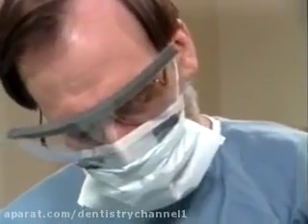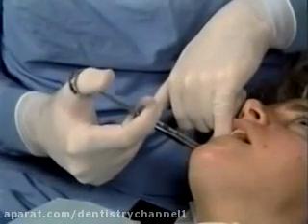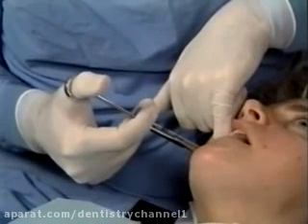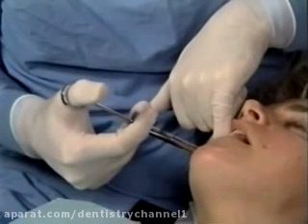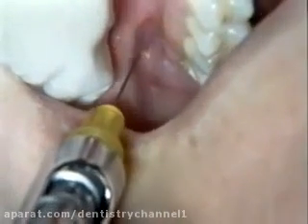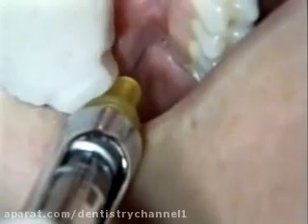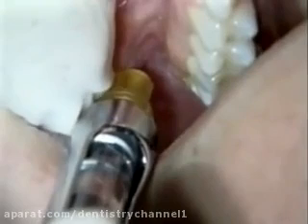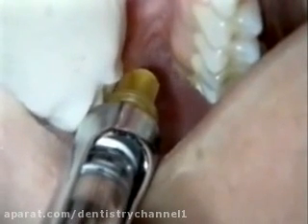The needle is carefully advanced to the insertion point and oriented medially as well as posteriorly and superiorly. For the average adult, the needle axis should be at an angle of 45 degrees to all three planes. The needle is slowly advanced to a depth of 15 millimeters. After careful aspiration, 1/2 to 1 cartridge of anesthetic solution, or about 1 to 1.8 milliliters, is slowly injected.